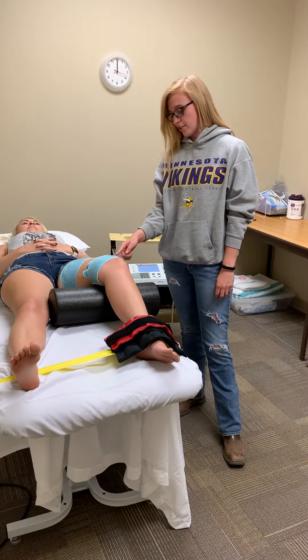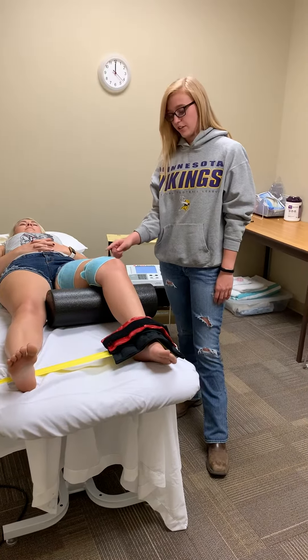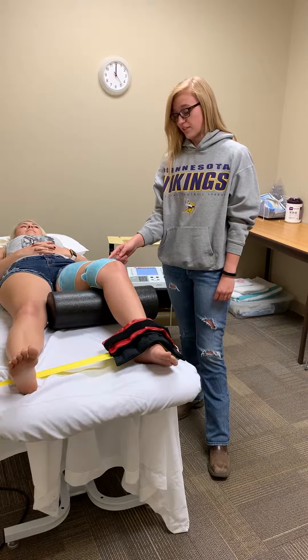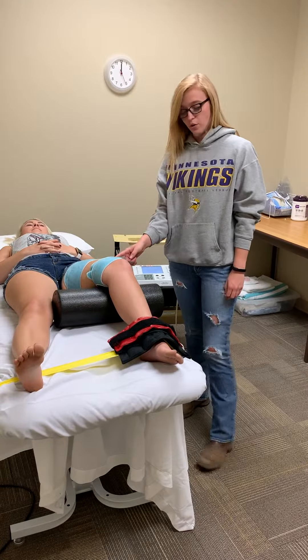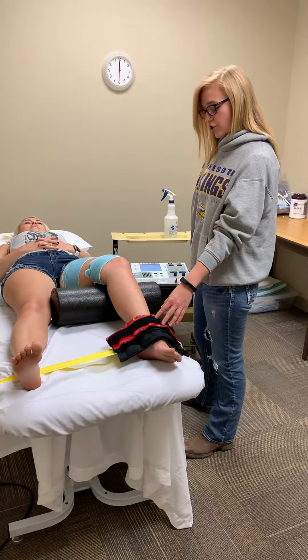We have two electrodes placed. The bigger one is placed on her femoral triangle and then the smaller one is over the medial aspect of her VMO. We then have ankle weights on her foot to make sure that it's an isometric contraction.